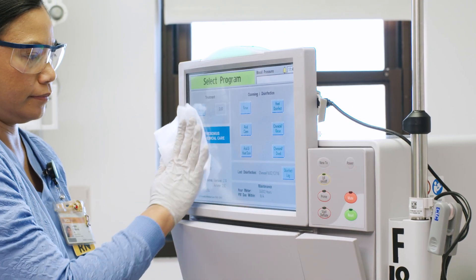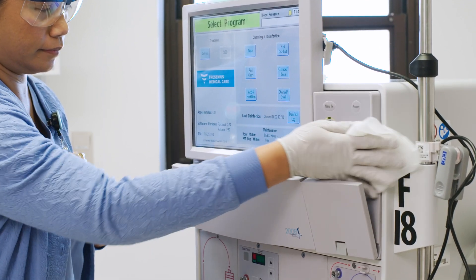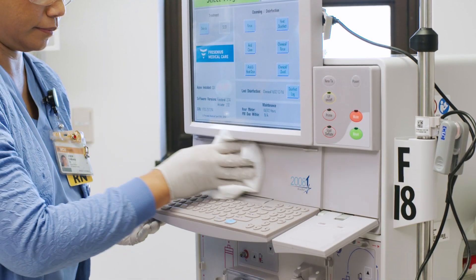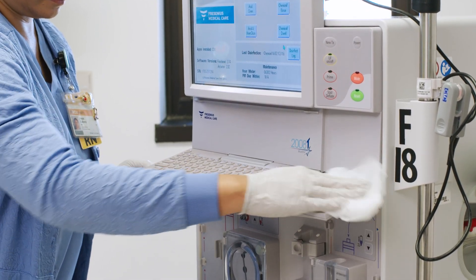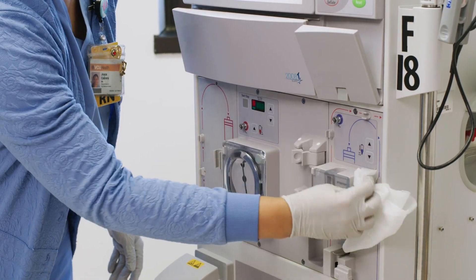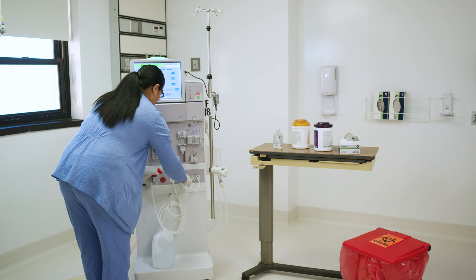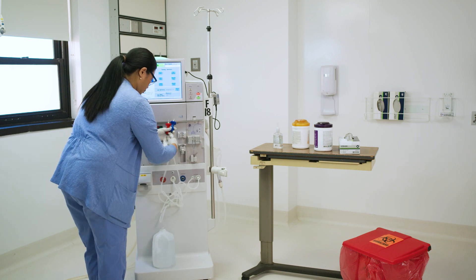Using a wiping motion and friction, start with the front of the machine, paying extra attention to high-touch surfaces like the screen, buttons, and keyboard. Take care to be thorough, wiping any tubes, latches, or other small components of the machine.